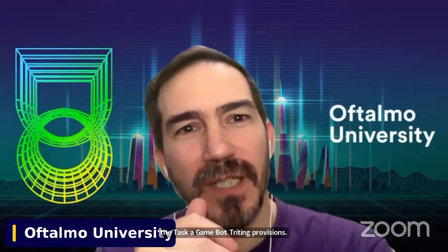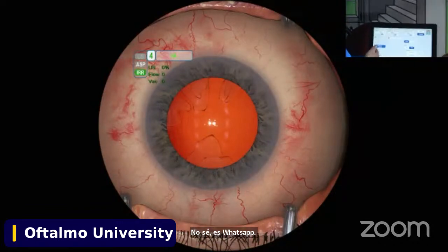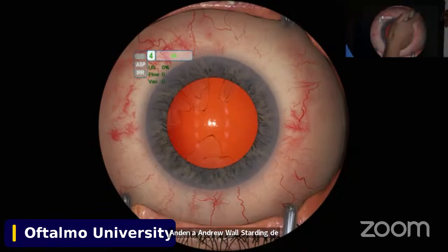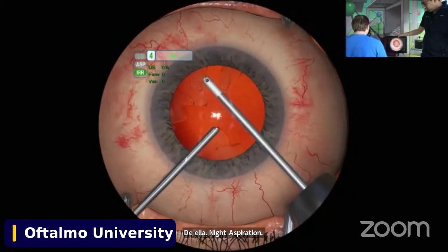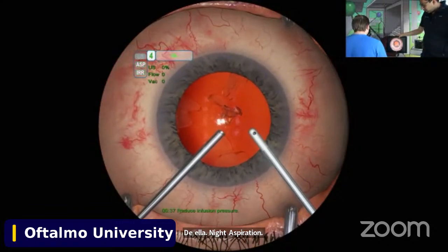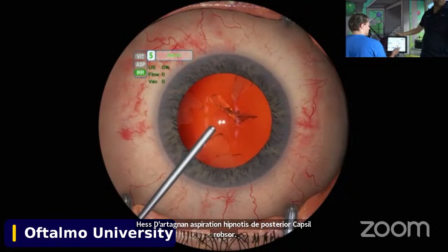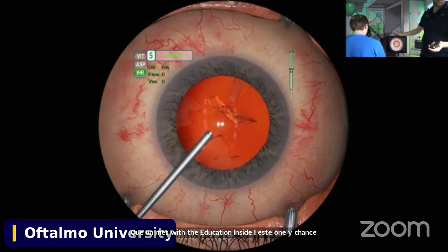That's the objective feedback that Florian was talking about. You get all those small details to improve, and you can measure it, and you can improve it in a visual way. Now, first, we have to put continuous irrigation, as you can see. And then Andrew will start doing the irrigation aspiration. He noticed the posterior capsule rupture. He remains with the irrigation inside the eye in step 1. He changed the parameters to continuous irrigation. And now he can start doing the anterior vitrectomy.